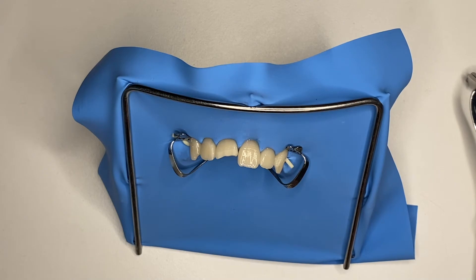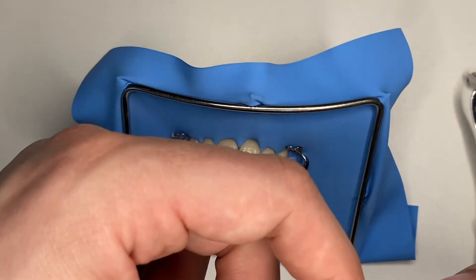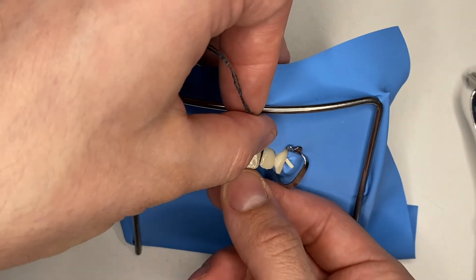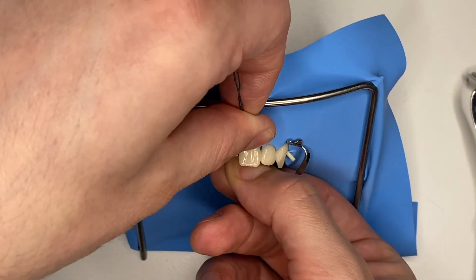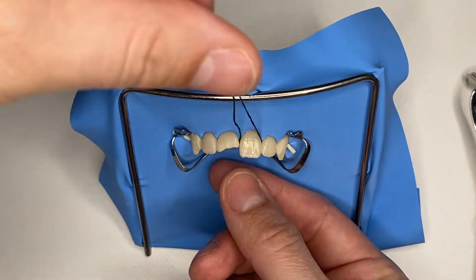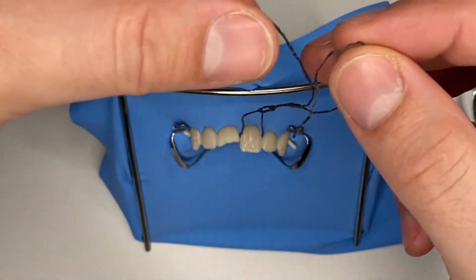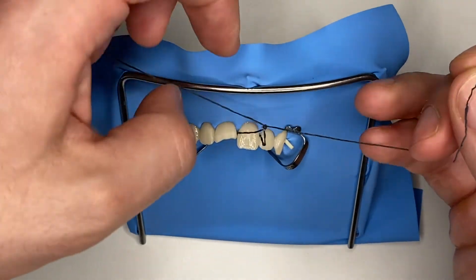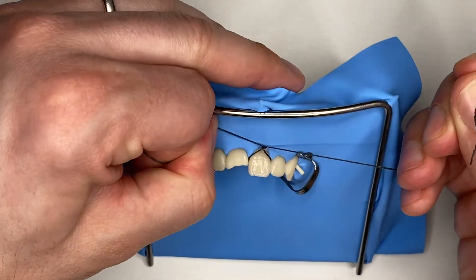I'm going to use this simple lasso. If you want to know how to make one of these, you can check out one of our previous videos. You're simply going to run it between your teeth, then grab the two laces and pull.